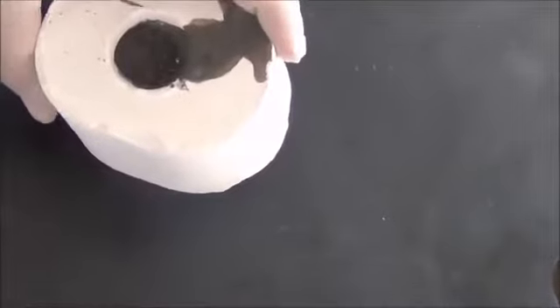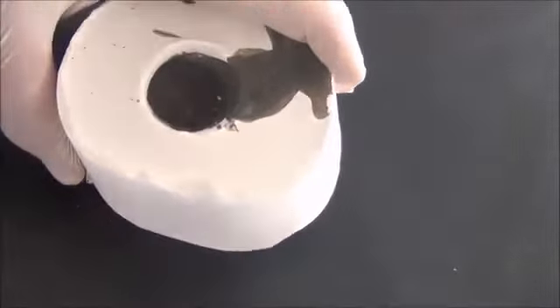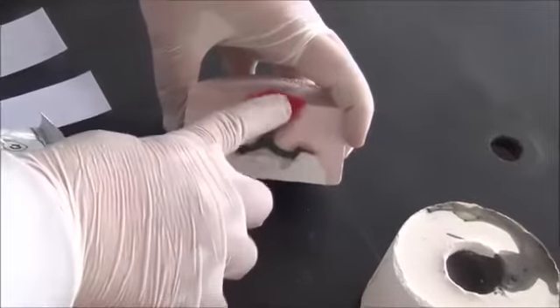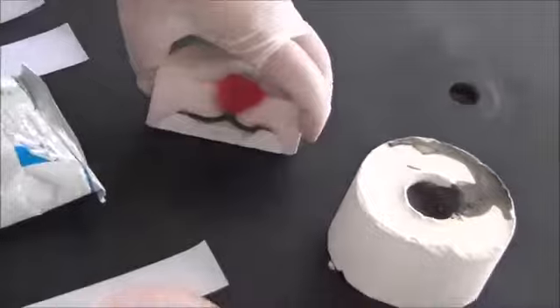And what I get now is metal inside this investment ring. So if I take the cross section of this, it will be this exact shape, but all of these are now replaced by metal. These are all in metal.